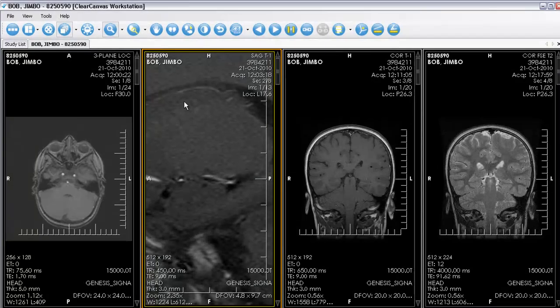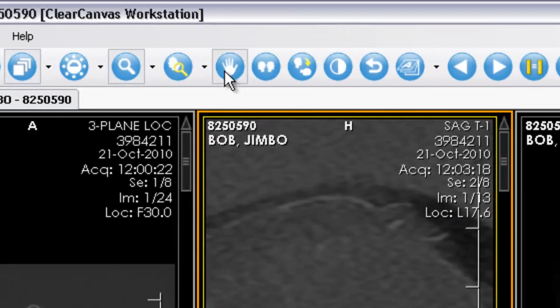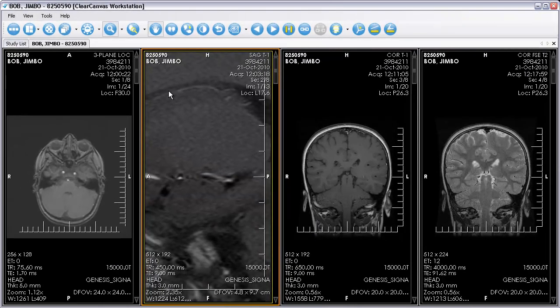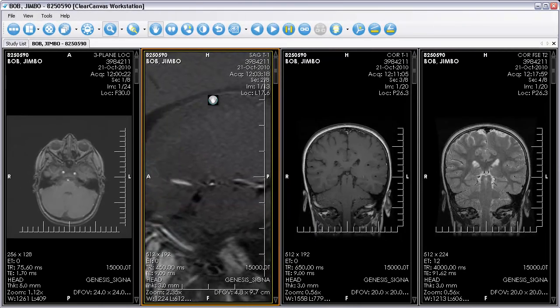The image can be panned using the pan tool. Once you've selected the pan tool from the toolbar, hold down the left mouse button and drag the image.